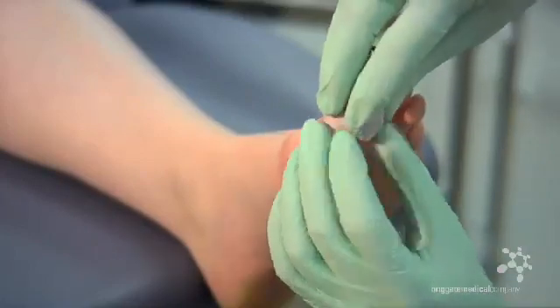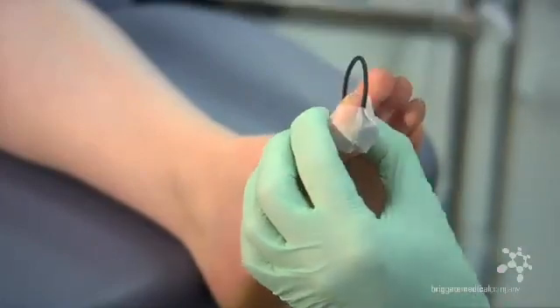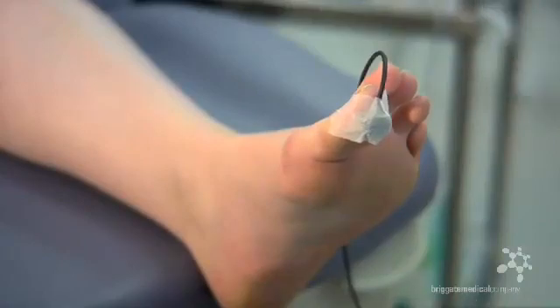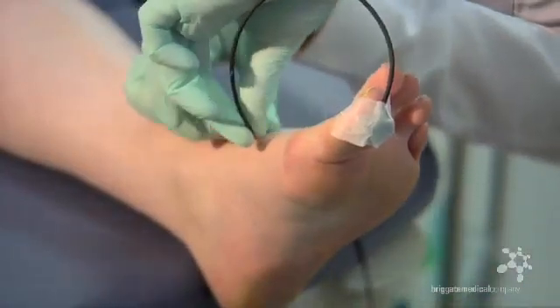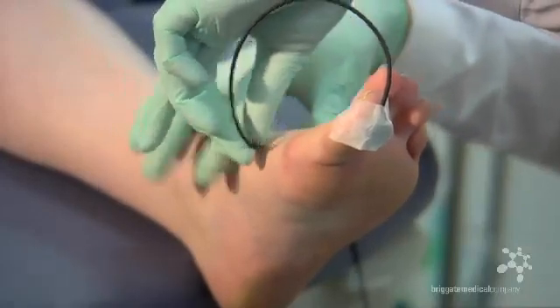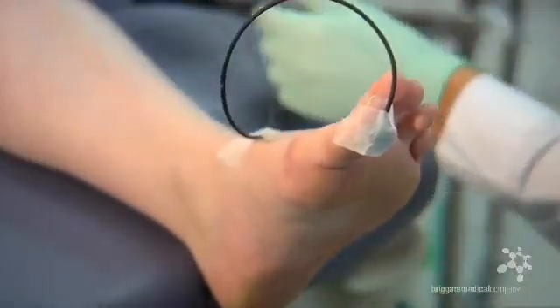2.5cm micropore tape seems to be the best for this job. We then suggest creating some slack in the wire and taping it off to the dorsal aspect of the foot as shown. This ensures no pull on the probe. Then run the wire up the leg of the patient.